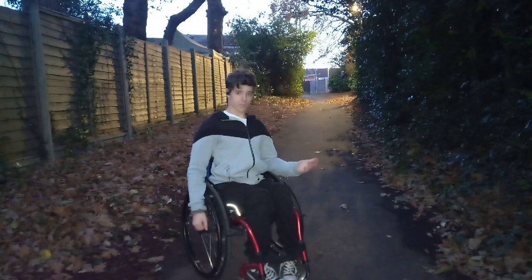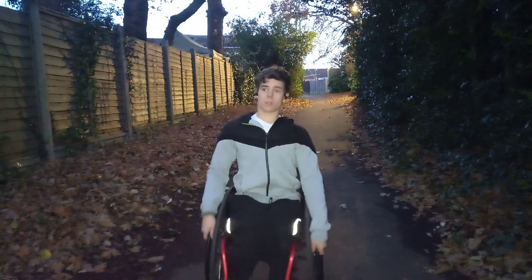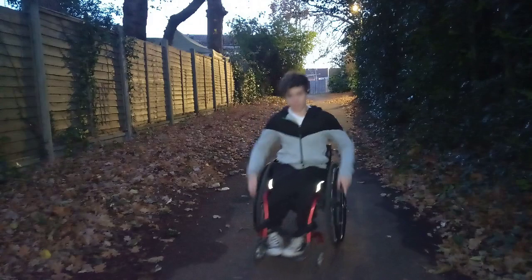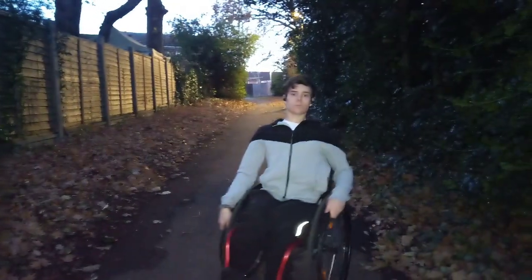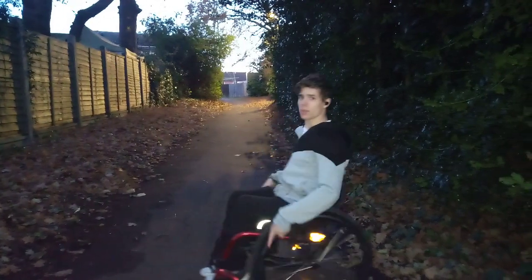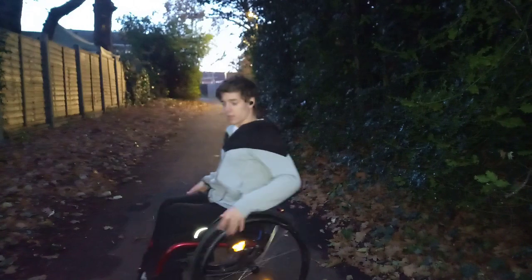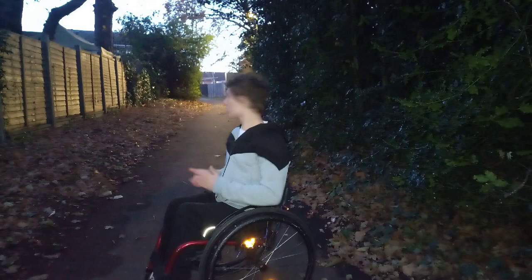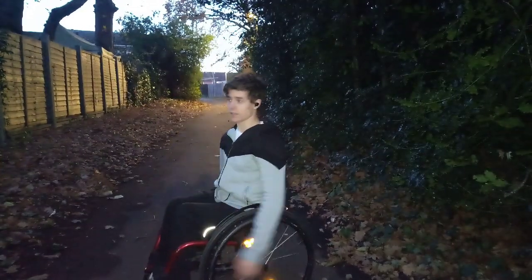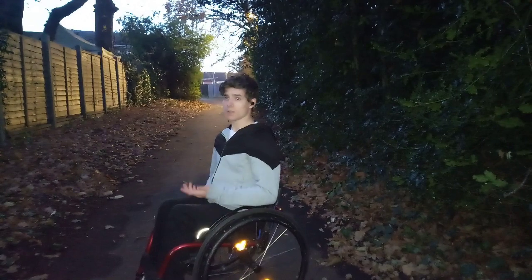Now, stopping is another issue, obviously. You'd want to be able to stop. What I'd recommend for that is pushing backwards, doing this, which is how you go backwards. That is always a massive help because normally if you're pushing along and you suddenly put on your brakes and hold on to your wheels, you're not going to go anywhere. But on the ice, you will just continue to move, and that's not what you want. So pulling backwards and reversing does help.